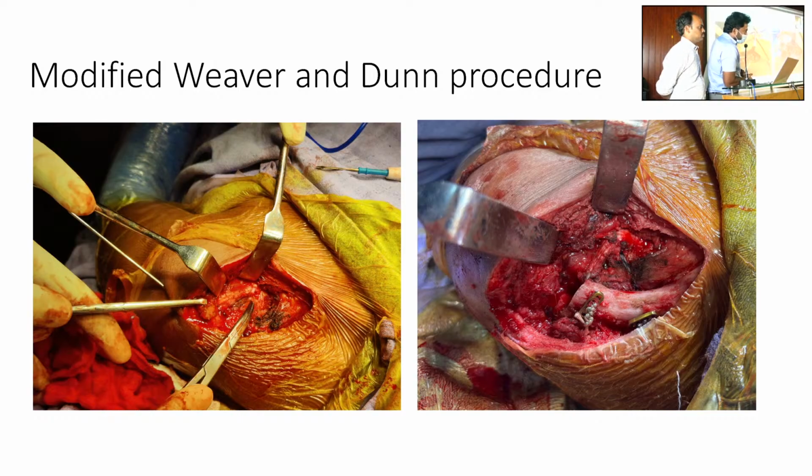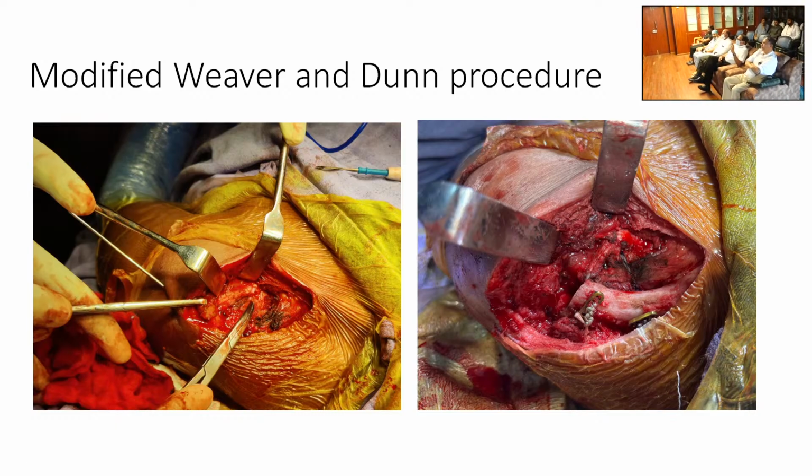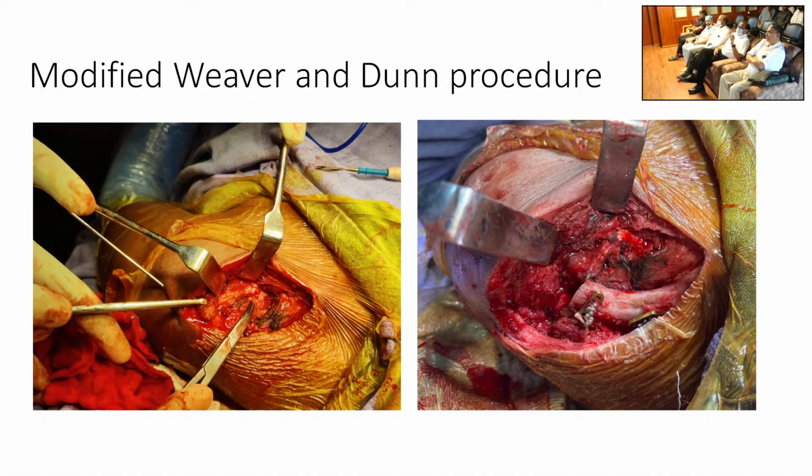Coracoacromial ligaments. So you put an endobutton. Yes, sir. So that's the coracoacromial ligaments here. Now new sutures have come. What is that? Like ACL. Polyethylene suture material, sir. It's called by some name.